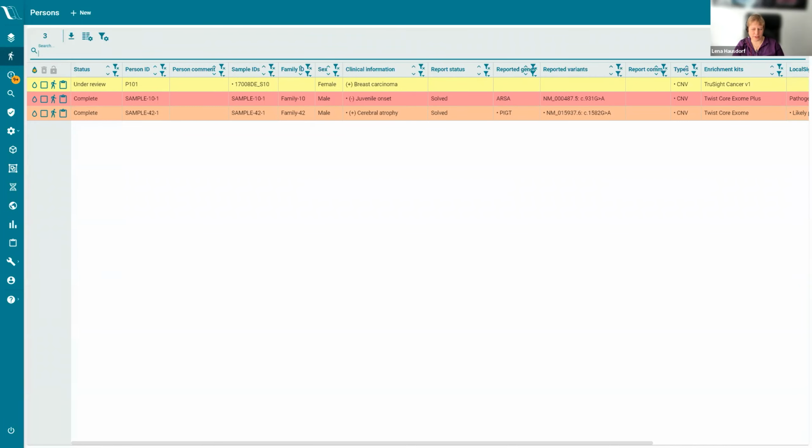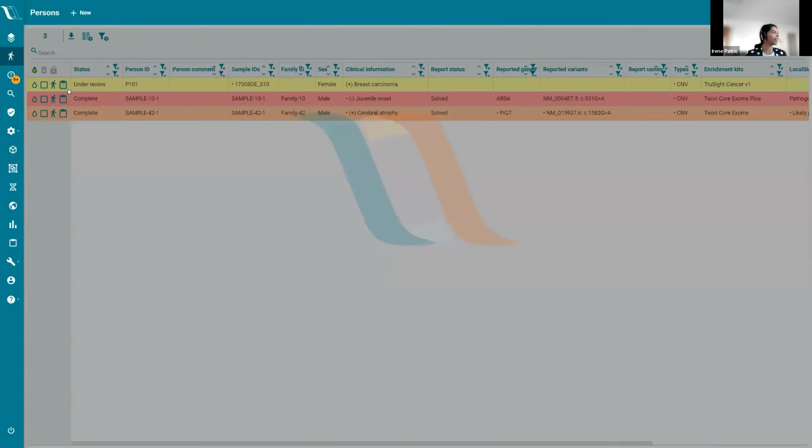If it's referring to the ACMG criteria, we don't have specific somatic ACMG criteria yet. If they are available, this would be something we could consider implementing.